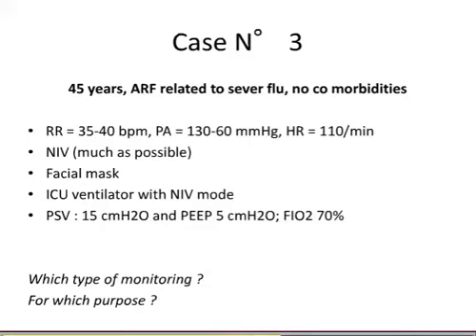NIV is started as much as possible with a facial mask, an ICU ventilator with the NIV mode, and this is the setting at the beginning of NIV.